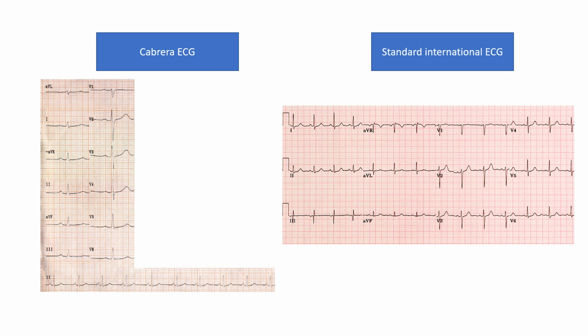I do think, though, that the potential benefits of this are bigger, but I do think there's a big problem with it: we know the standard ECG and we know some gestalts from it. I know where to look. My eyes look at certain places on this ECG.